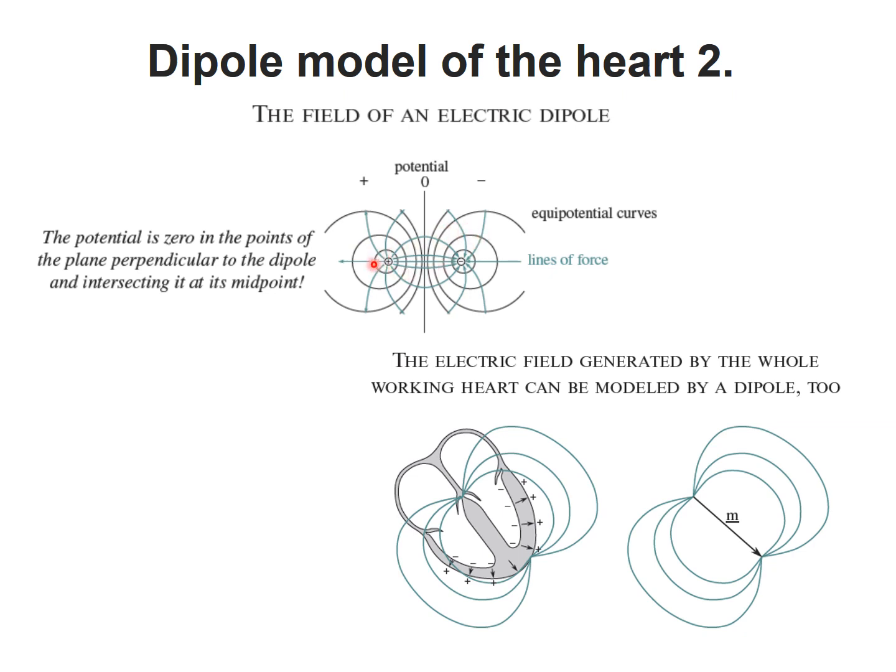We record the highest difference when we put the voltage meter in the center of this dipole and when we are parallel with this vector. And of course, when we are perpendicular, because the electric field has the same kind of charges, we do not record anything. So the potential difference that can be recorded in this electric field is proportional to the angle between the dipole axis and the measurement axis, the cosine alpha of this angle.